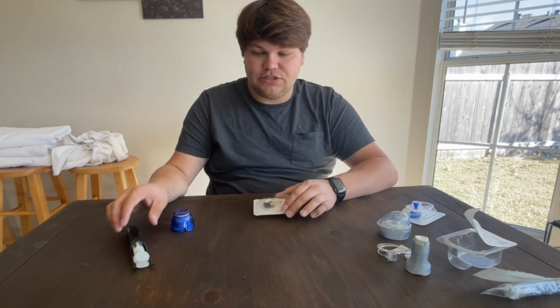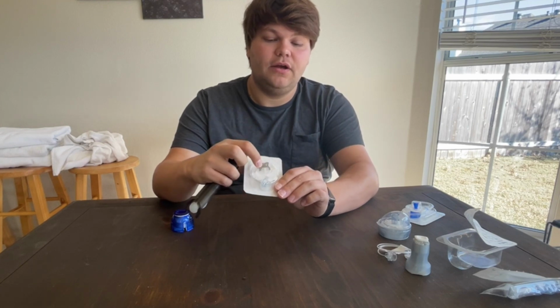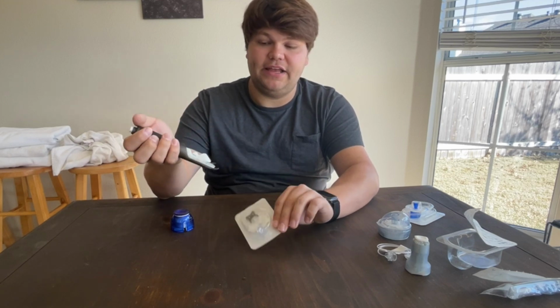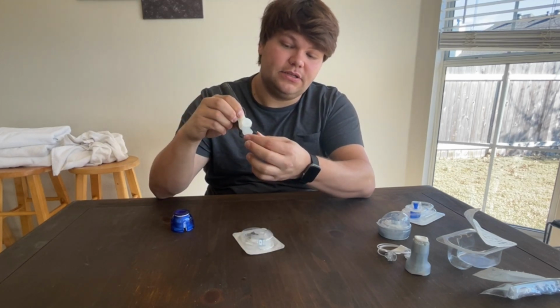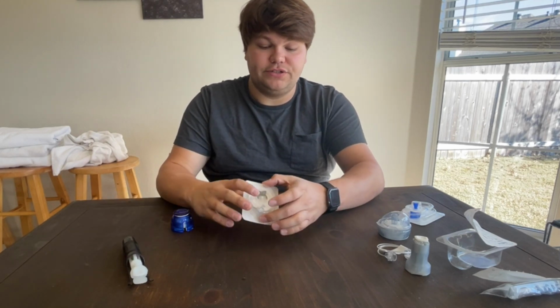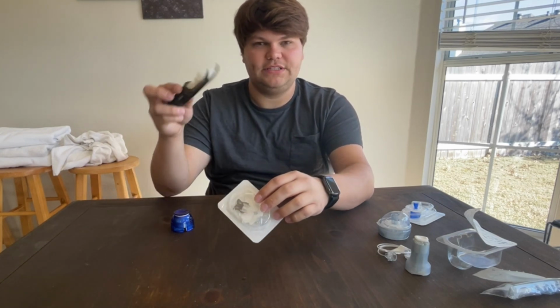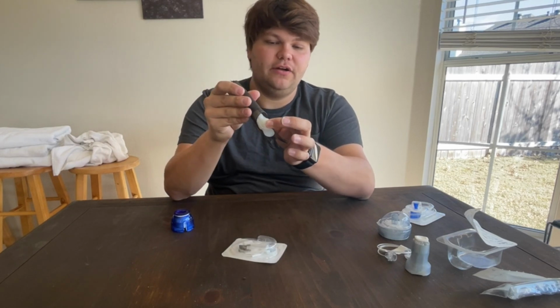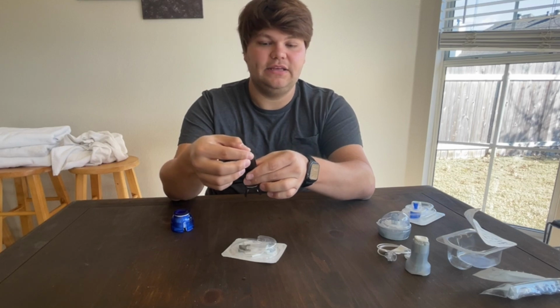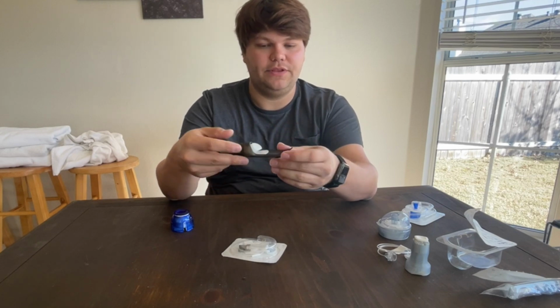So basically the way this works is you can see this gray piece in here. That's the infusion set. And when you take that out, the tubing is not attached. You have to put that gray piece, you lift this up and pop it in there. Then there's the little blue piece over the cannula. You're gonna pull that out once it's in this. And then you take your finger and lock that in, and there is a safety lock on the end. If you're worried about accidentally bumping it, you can turn it and it will not fire the inserter, which I do like that with this.